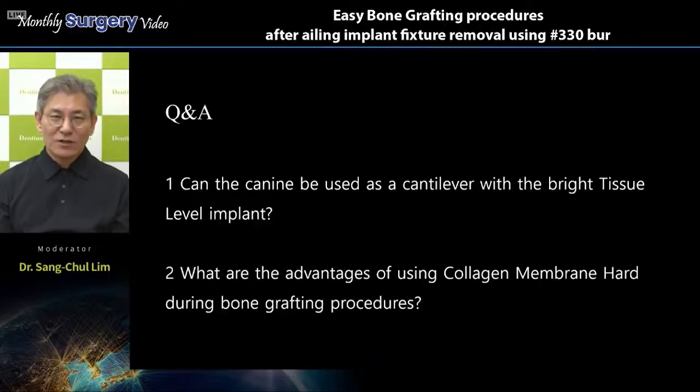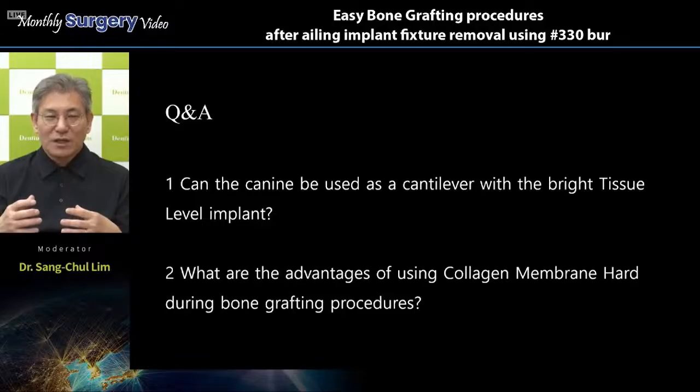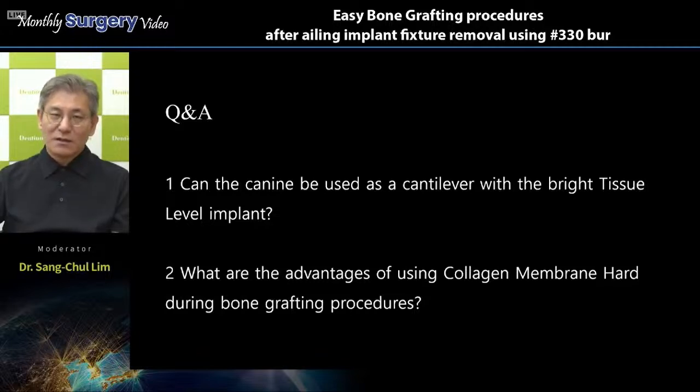Let's see. Can you remember during the surgery procedure, Dr. Chung placed the first implantation on number 32 area before removing the neighboring failing implant fixture, right? Why? Because this area is very important, like the natural dentition's canine portion, right? So he doesn't want any bone loosening. Let's see, after removing the failing implants, all implant fixtures, and then the bone grafting or the installation, make osteotomy.